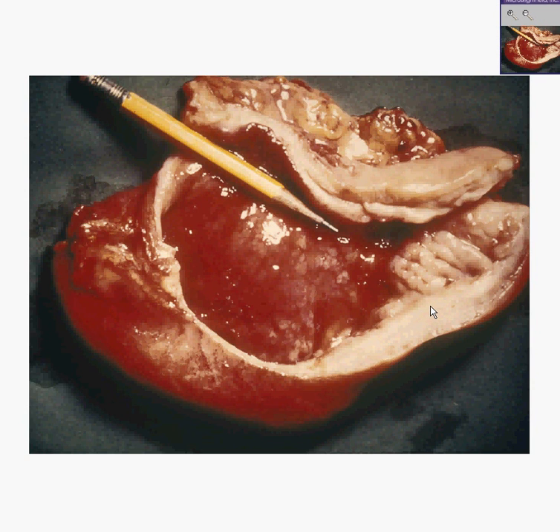It's a poorly differentiated adenocarcinoma. The bulk of the tumor consists of poorly differentiated, perhaps abortive glands or signet ring cells, diffusely throughout all three layers of the stomach wall.